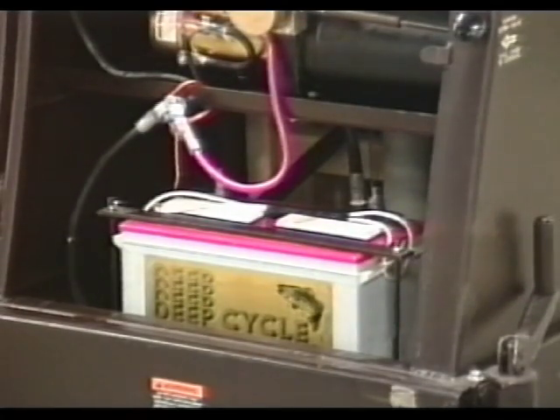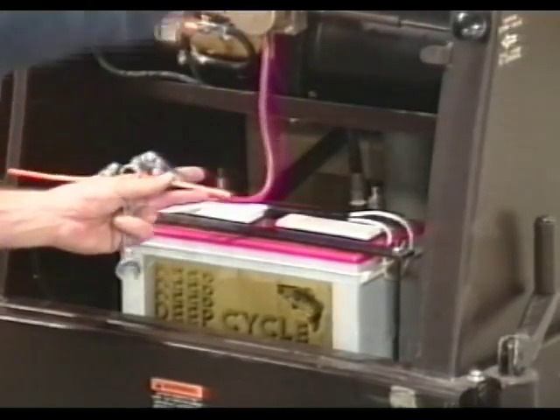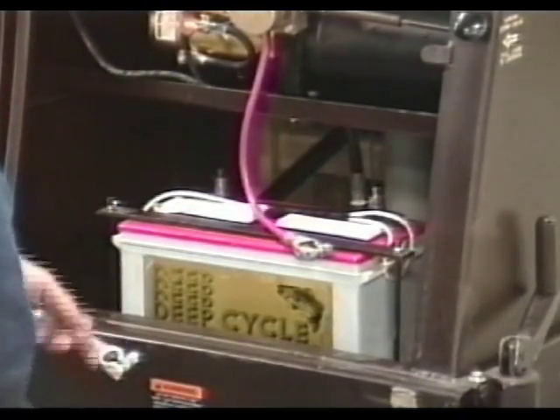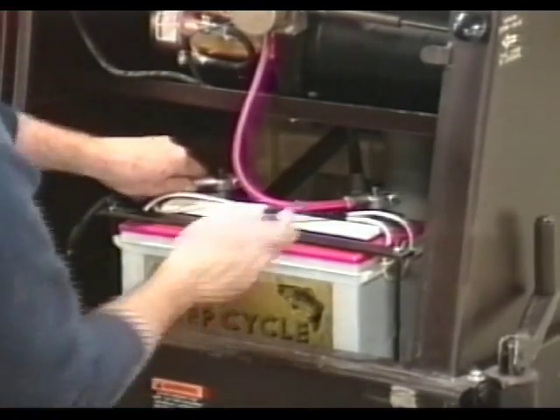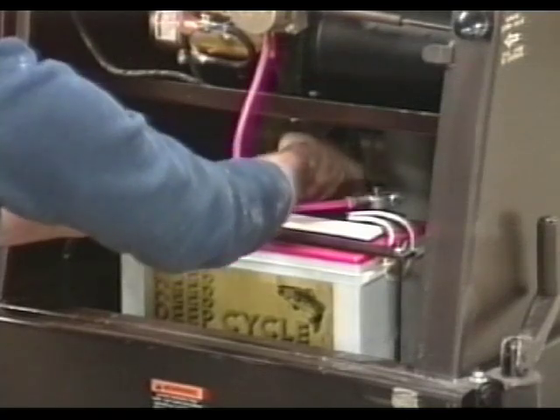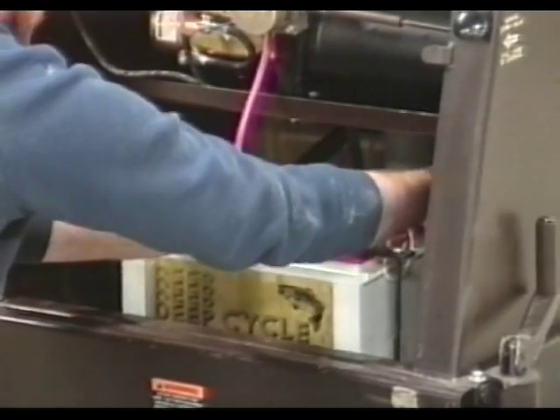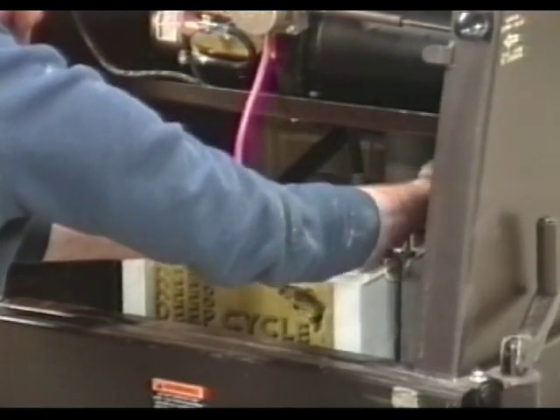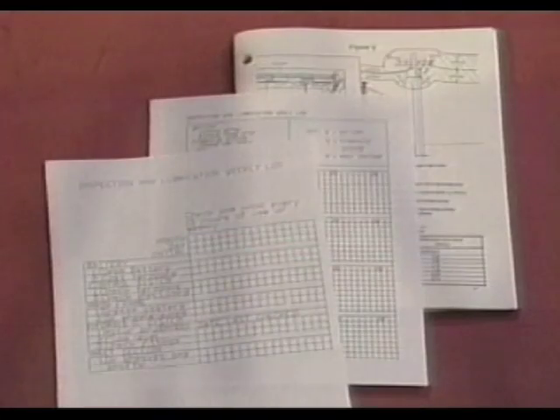New DC hydraulic Maxi lifts are shipped with the battery disconnected. Before operating the Maxi lift, the rear equipment access door must be opened and the plastic tie removed to free both battery cables. The cables must be placed on the proper terminals, and using a 1/2-inch open end wrench, the connectors must be tightened securely. At this time, it would be wise to coat the terminals with petroleum jelly. Close the rear door and proceed with the operational checks.